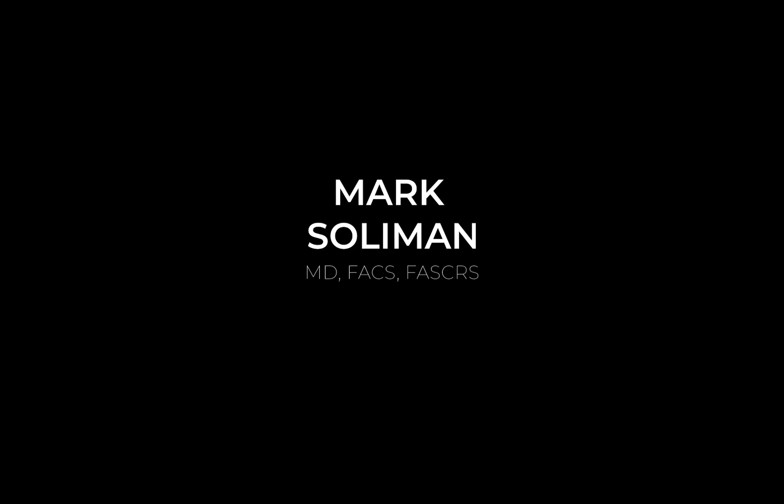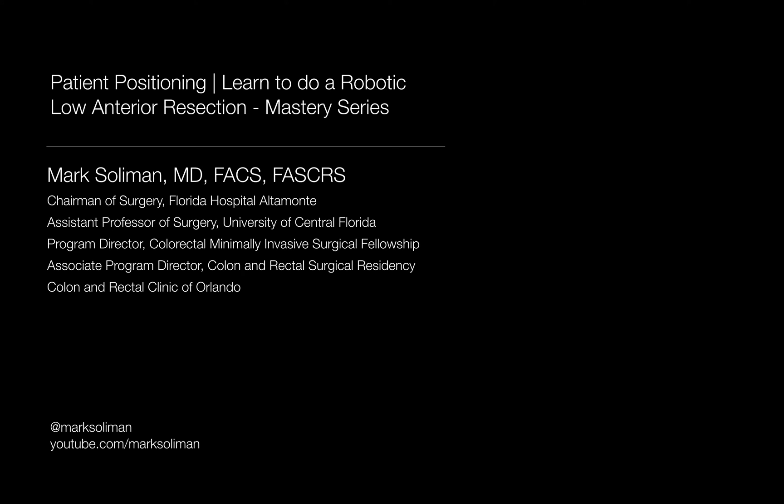In this video, I'm covering the nuances of patient positioning and room setup for a robotic low anterior resection with total mesorectal excision, for both the Xi and Si robotic systems.